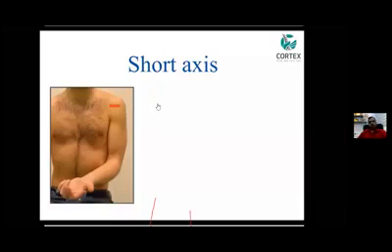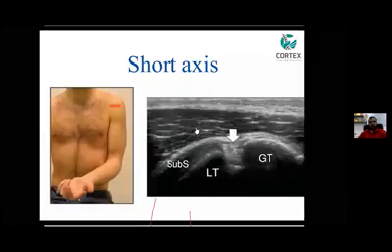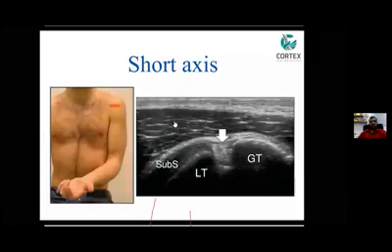At that point, we'll go for a biceps tendon sheath injection. Here you can do a short axis examination, which I have already shown. Keep the probe in short axis, find the tendon, then assess the depth from the skin to this area, and you can start that much distance below the probe. You can start from lateral to medial, which is easier. Using the in-plane technique, you can see the entire length of the needle in short axis. You do the procedure like that and enter the tendon sheath.